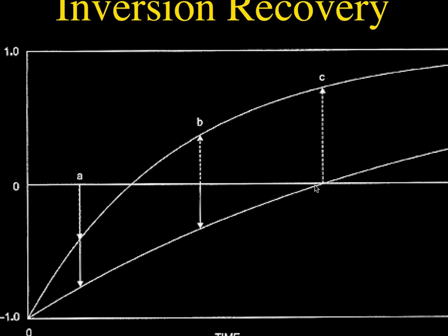It was originally created in brain imaging in order to be able to see periventricular signal abnormalities. They were often obscured by the very bright signal of the water in the ventricles on T2-weighted images. By nullifying the water, you're able to see the periventricular white matter changes much more prominently.